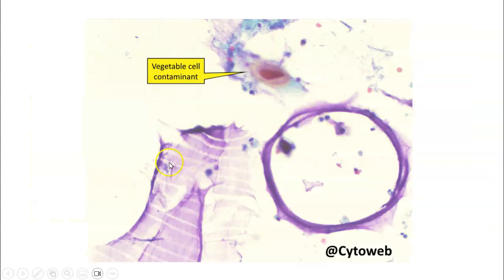And you can also sometimes see this kind of striated material that looks a bit like mucin. You can see this in urine, and you can see this sometimes in peritoneal fluid. And this is actually lubricant. So don't mistake this for mucin. It should be negative for DPAS.